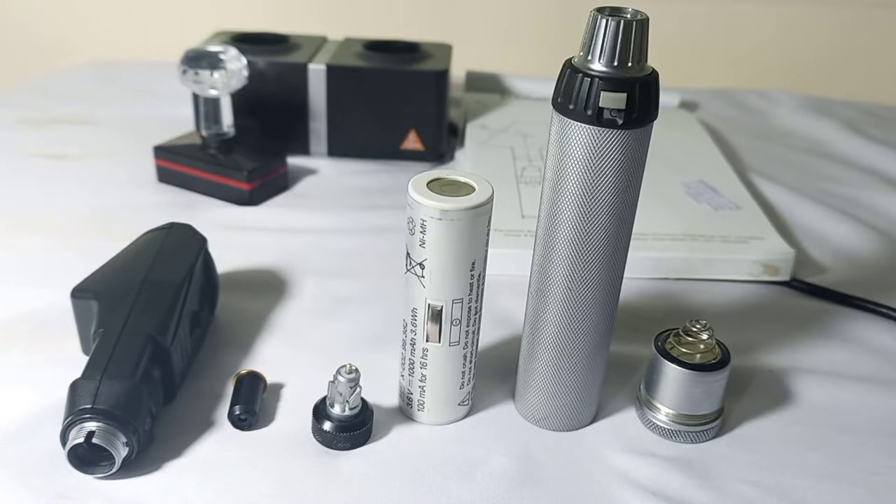We have the different parts of the retinoscope laid out, and now we will learn how to fix all these different parts of the retinoscope together.